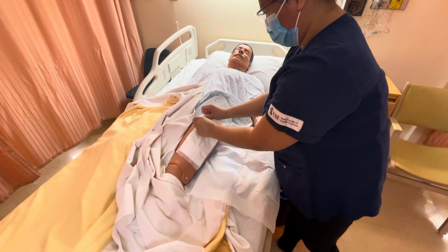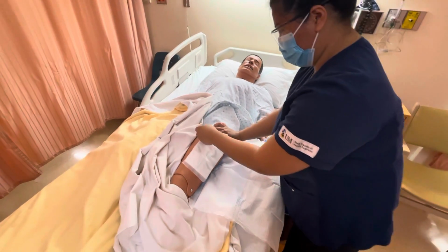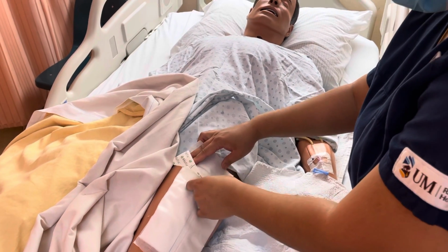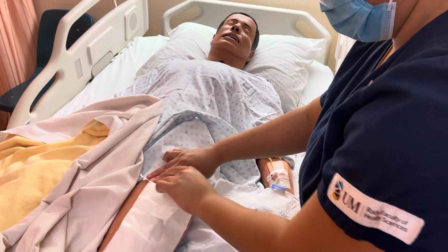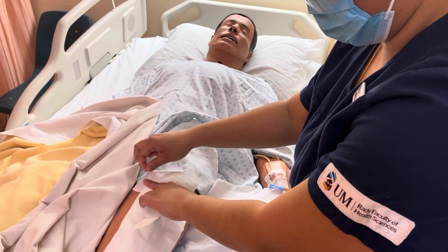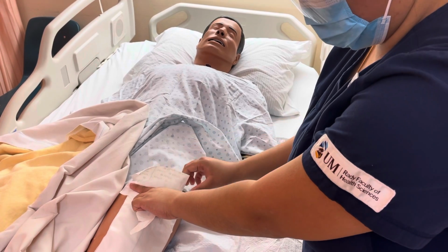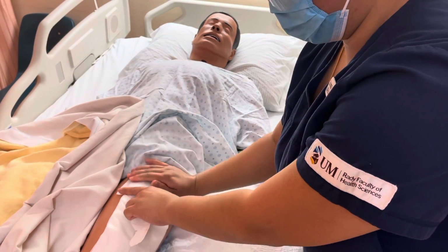And then so I can take the garbage bag, have it to myself, and take this down. And place nearby. Right. So now I'm going to... Okay, there we go.